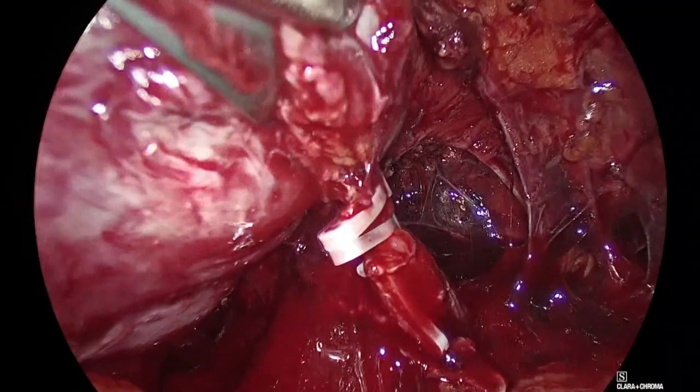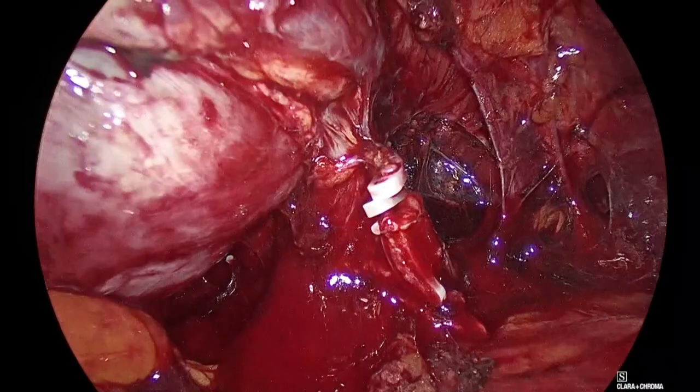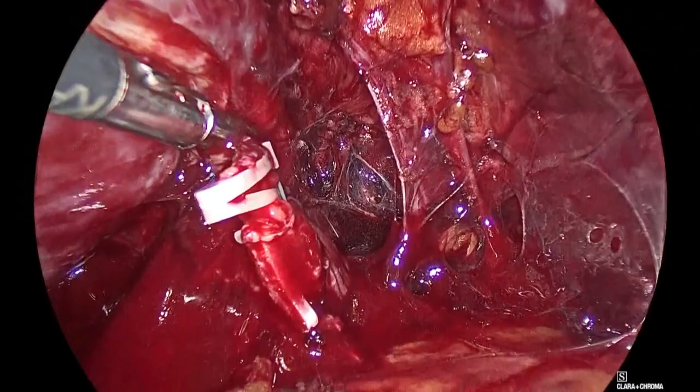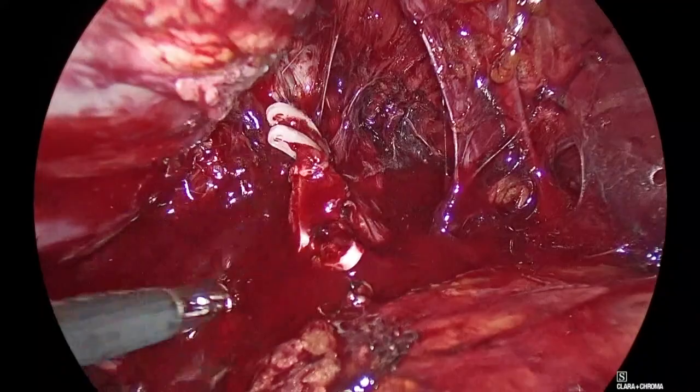Show me, Padeli. Good. Duck, please. Duck. We have names for the graspers, so it's easier to communicate. Duck is this nice small grasper. Again, you see the vision here that you have with the 4K system. We're using the Storz 4K system. It's really amazing. The 4K for me is amazing. Go back. Go back. Aspirate, Panagiotis.